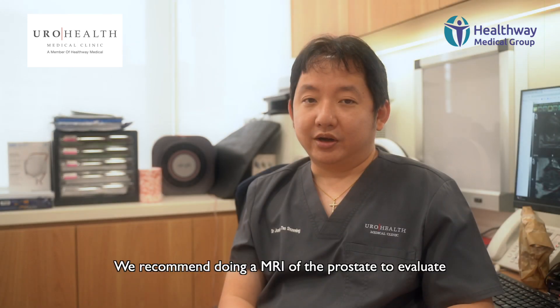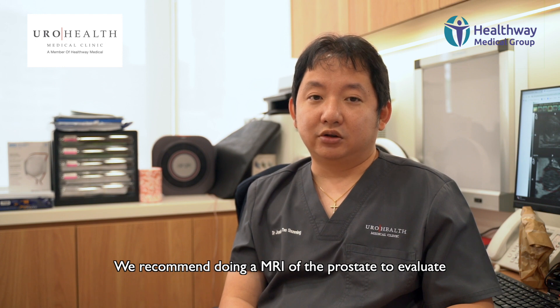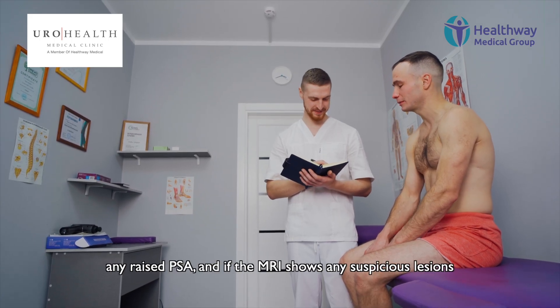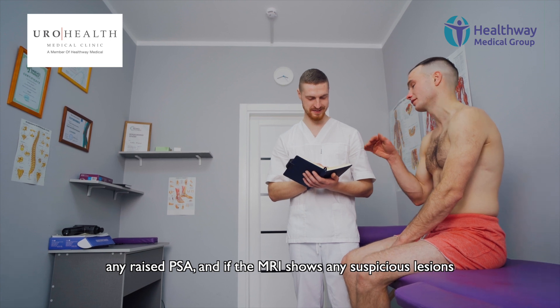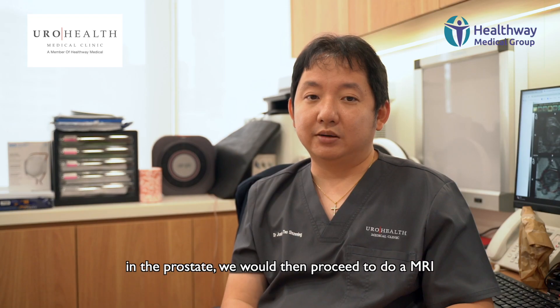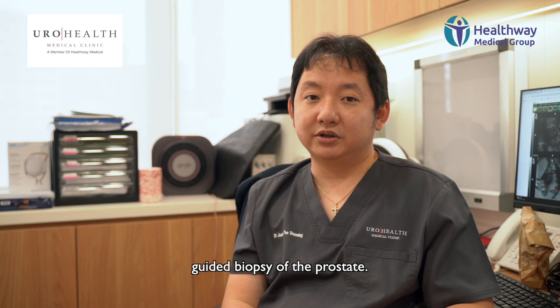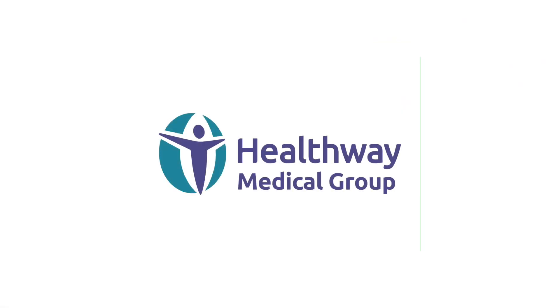We recommend doing an MRI of the prostate to evaluate any raised PSA, and if the MRI shows any suspicious lesions in the prostate, we would then proceed to do an MRI-guided biopsy of the prostate.